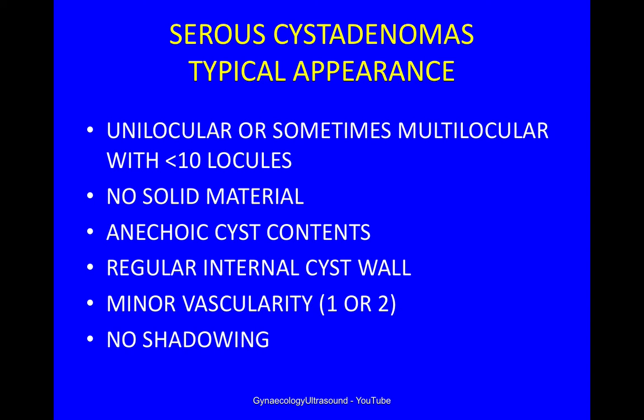The typical appearance of a serous cystadenoma is a unilocular or sometimes multilocular cyst with fewer than 10 locules, no solid material, anechoic cyst contents or occasionally low level echogenicity, a regular internal cyst wall, minor vascularity — score of 1 or 2 — and no shadowing, though sometimes there is shadowing, which is a benign feature.